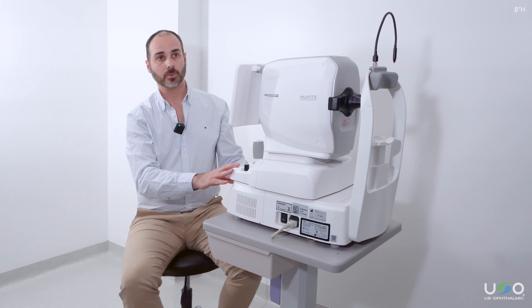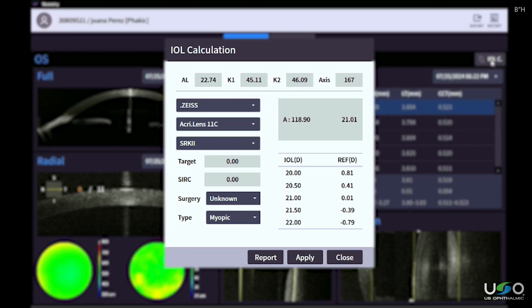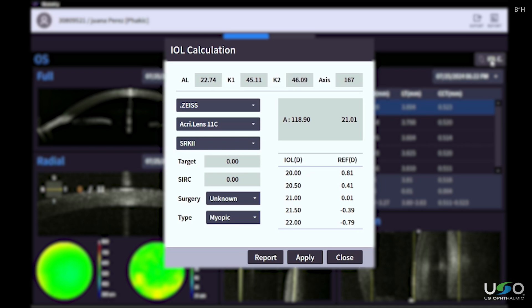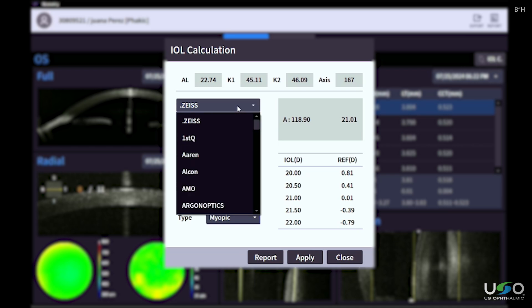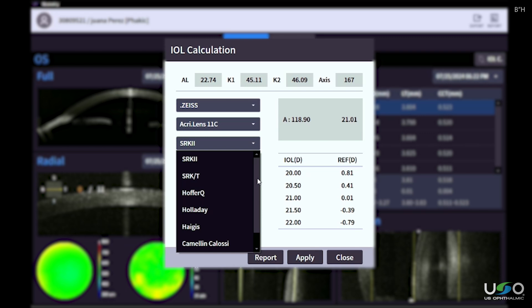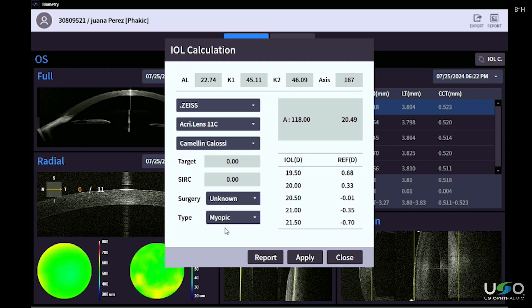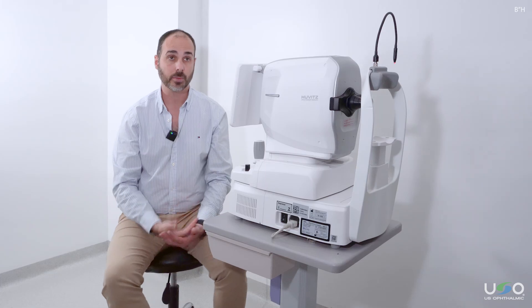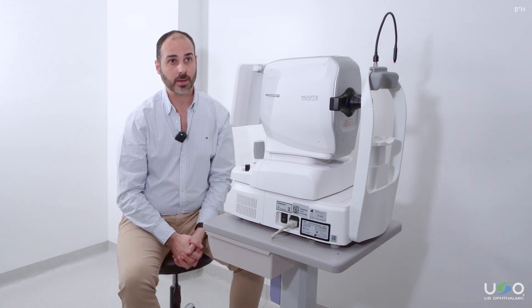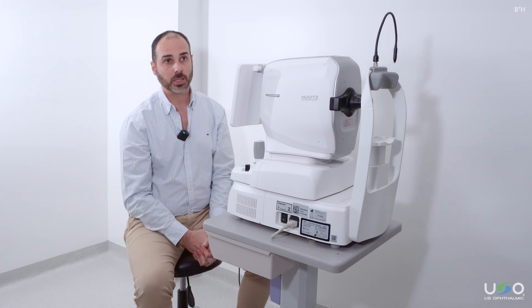Another important feature when doing the biometry analysis is that we can use the built-in calculator incorporated in the OCT. In this case, we have the measurements of the left eye — axial length, K1, K2, and the axis. We will be able to choose from multiple lens manufacturers and their models, as well as the formulas SRK2, SRKT, HoferQ, Holladay, Hygis, Camelin-Colosi, and Shamas. This way, we will be able to correctly choose the lens we want to use with the biometry. It is also important to clarify that if a lens is not in the updated database, we can add it manually, which is an important alternative for considering non-standard lenses.